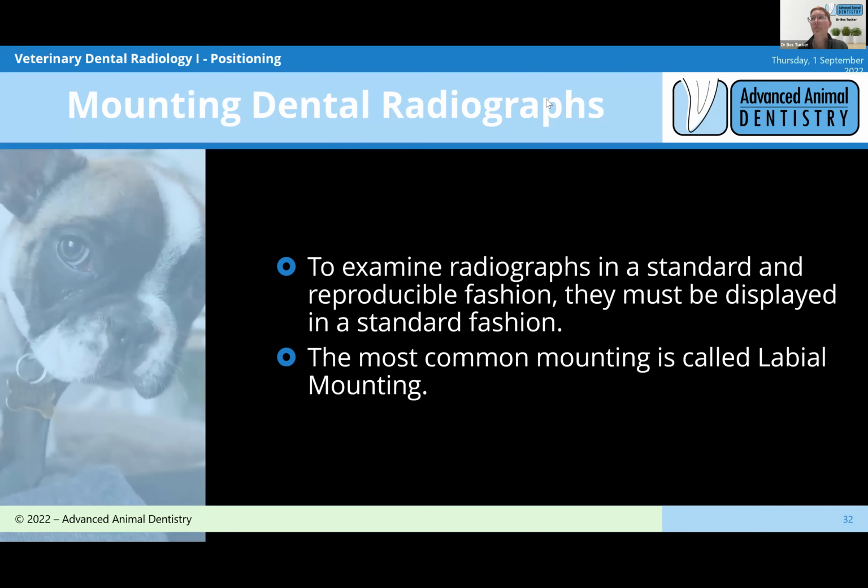That will give you excellent images. I think the best part of changing over to the CR for us was being able to image the rostral mandible a little bit more easily with parallel technique. But certainly the bisecting technique can be applied with relative ease to that mandible as well once you get the concept. As Beck said, you put the plate across both arcades, and then those teeth are sitting at about 90 degrees to that. So what's half of 90 degrees? 45 degrees. It's actually a good demonstrator of bisecting angle technique.